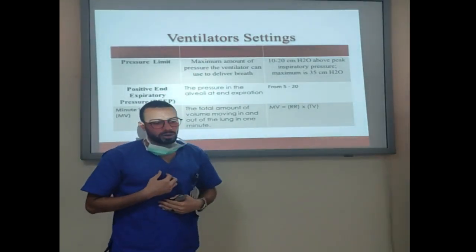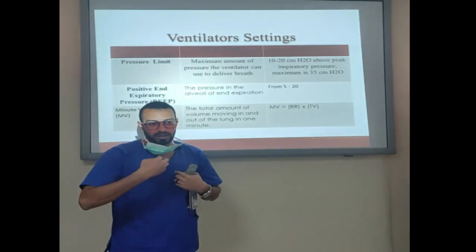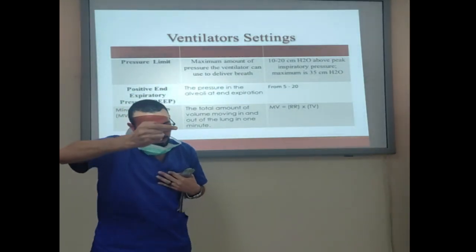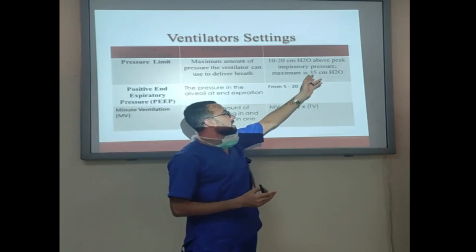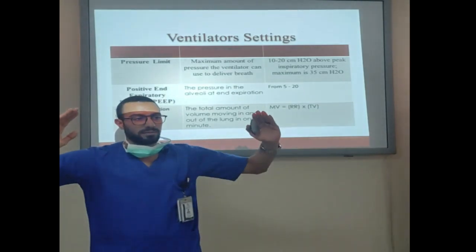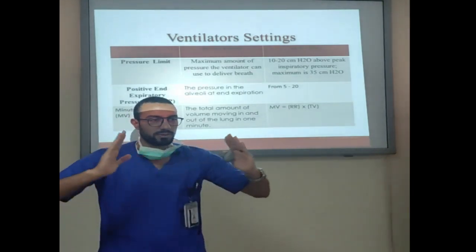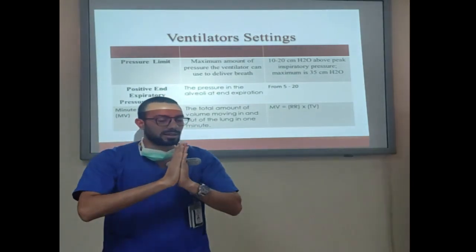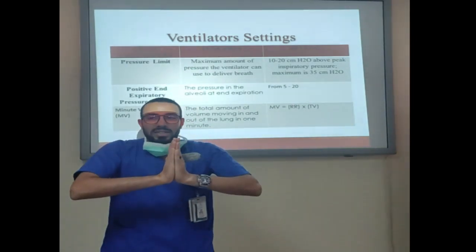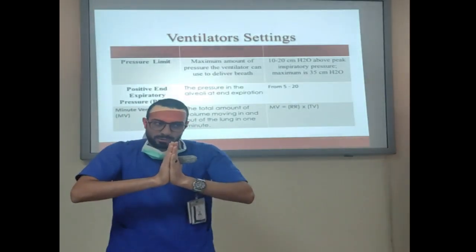Like this time, you have pressure inside. This kind of pressure, if you add above it the new inspired breath, will get more pressure. It will reach at the end 35. So I mean, the lung will move like this. It will inflate and deflate like this, not like this. Normally, if you have complete deflation, you will suffer something called atelectasis. Atelectasis means that it's a total lung collapse. You don't want this collapse to happen.